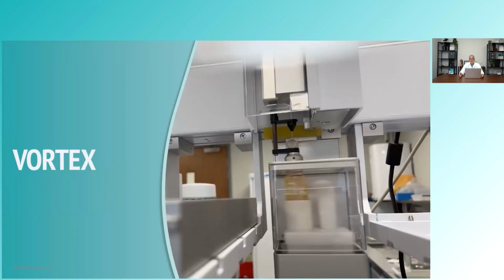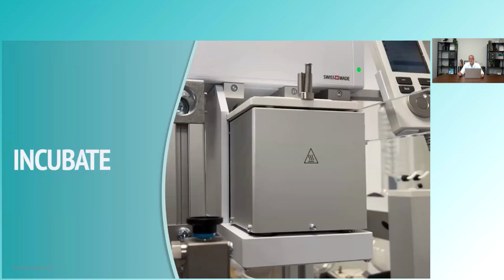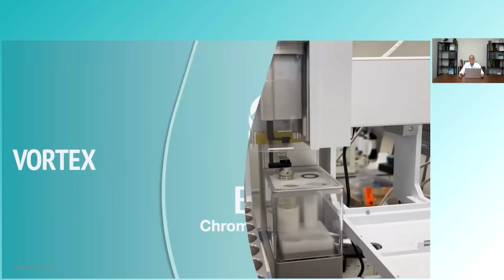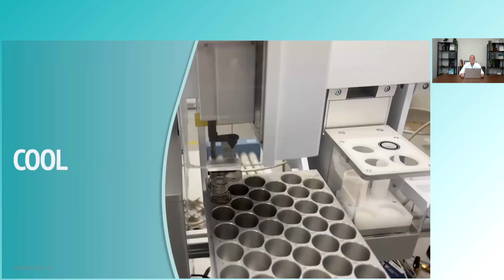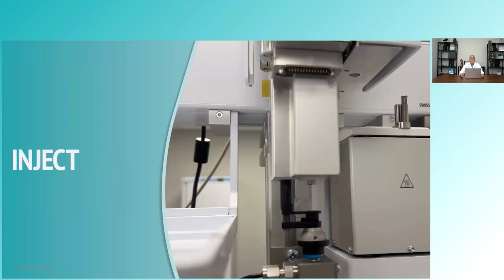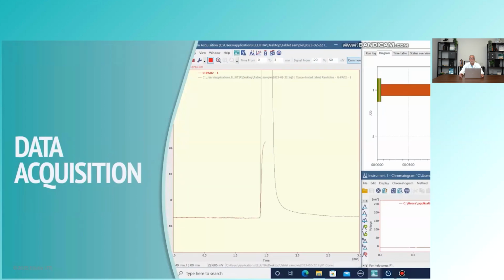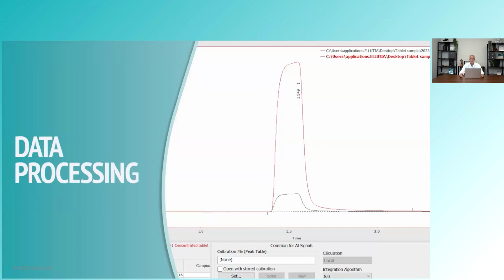Now, here the sample is vortexed before going into the heated agitator, where the reaction occurs to release the NO. The sample is then vortexed once more to help release the NO into the headspace, before being allowed to cool. An aliquot then of the headspace is injected into the TEA inlet for analysis. We did also perform a 10-fold dilution of this sample so that we would have the concentration within the linear dynamic range for the calibration curve.